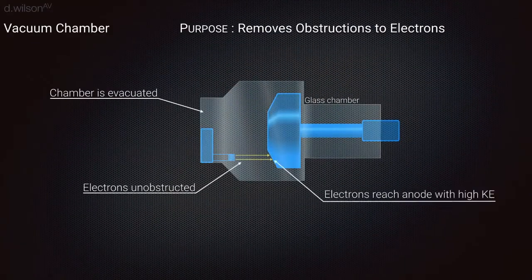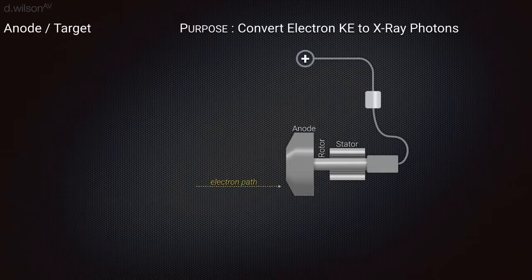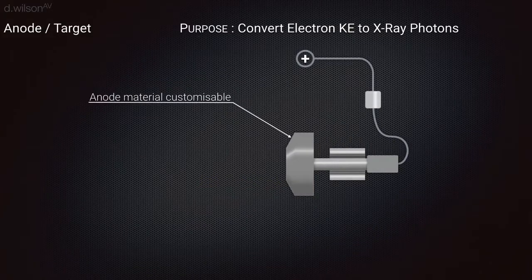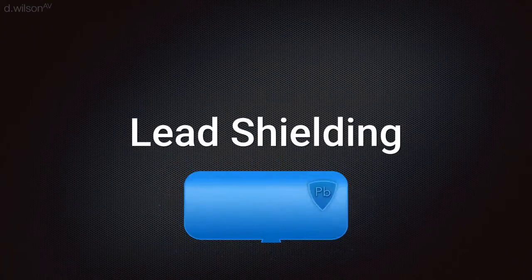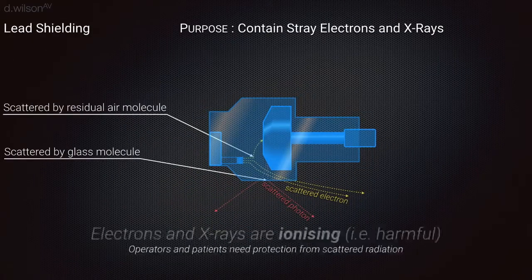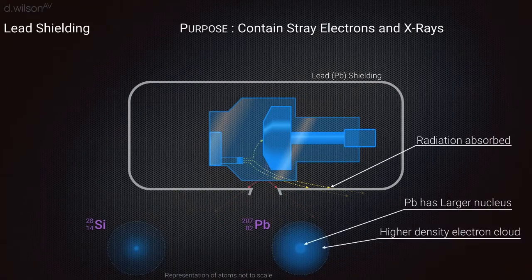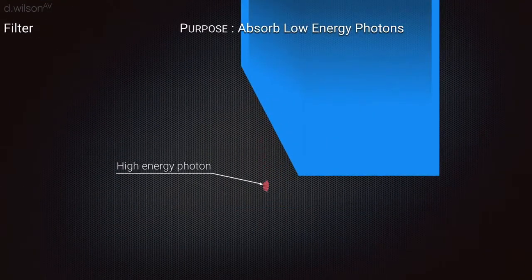Soft tissue such as skin and organs cannot absorb the high-energy rays, and the beam passes through them. Dense materials inside our bodies, like bones, absorb the radiation. Much like camera film, the X-ray film develops depending on which areas were exposed to the X-rays. Black areas on an X-ray represent areas where the X-rays have passed through soft tissues. White areas show where denser tissues, such as bones, have absorbed the X-rays.